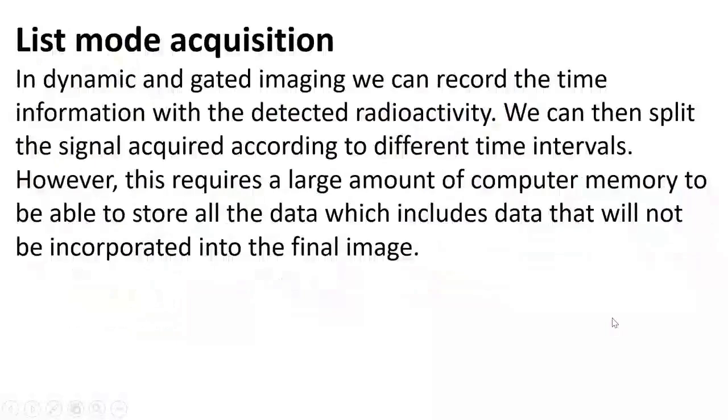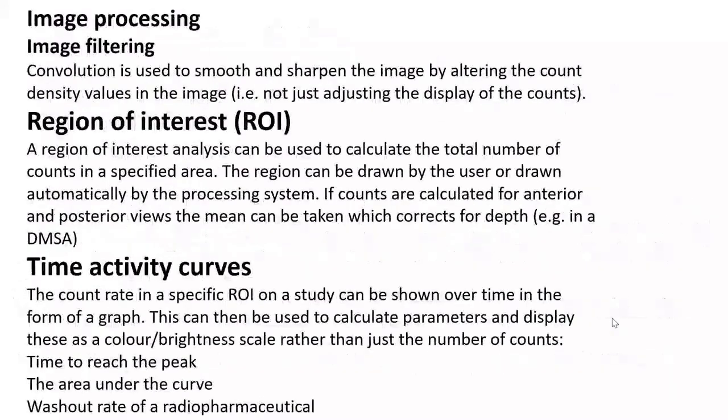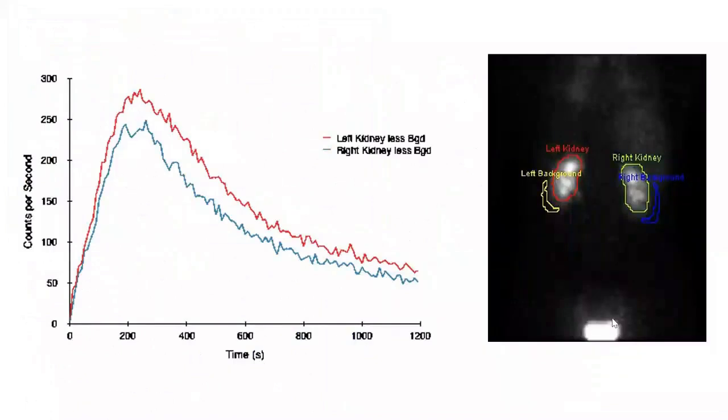Let's continue, God willing, with our discussion. We are also discussing dynamic imaging and how the region of interest, its shape, and usage allow you to calculate counts by time, giving you the time activity curve that you can create through the calculations or the spread function of the whole. So, just to let you know.